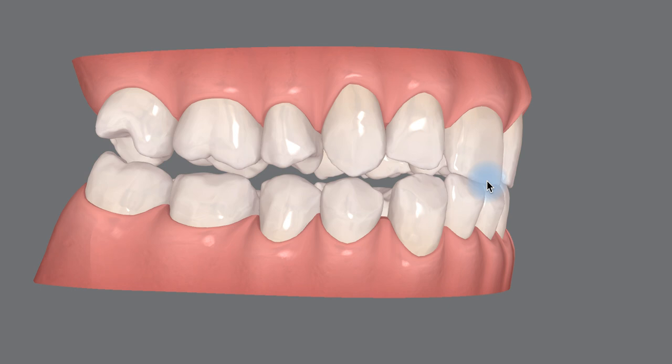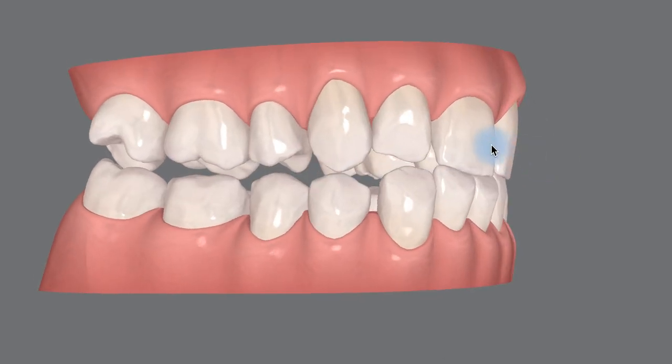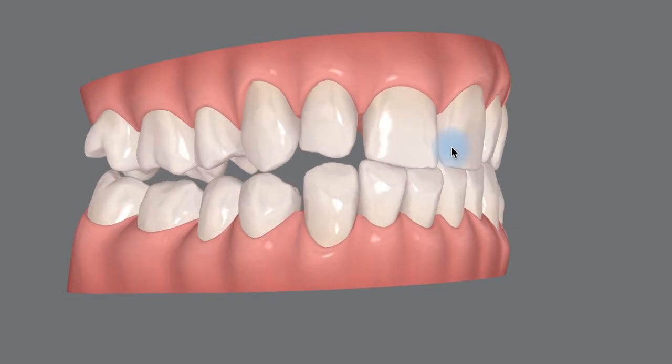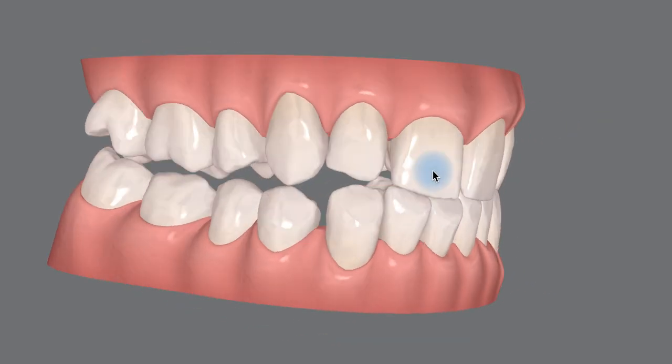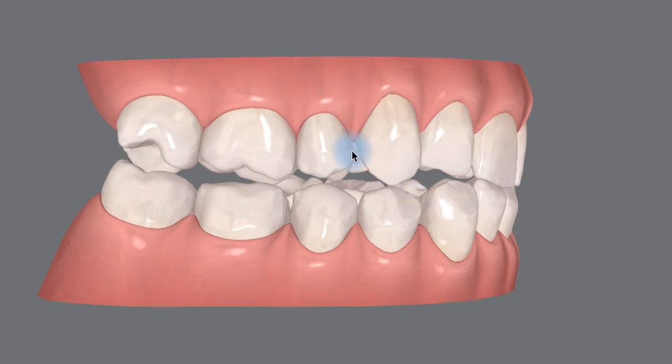So we had met and talked about using Invisalign to take these teeth and procline them forward in order to create some overjet so that your back teeth can come together. We'd obviously close all the spaces on the lower in order to gain some access. But what I'm confused about is the fact that you had your upper premolars removed when you were a kid during your orthodontic care, but the way your jaw lines up now, I'm perplexed on why they did that.